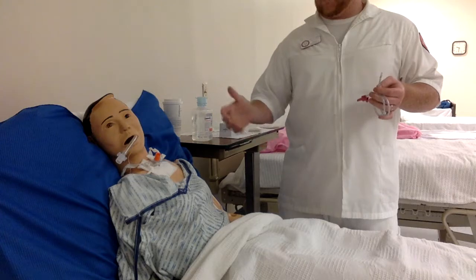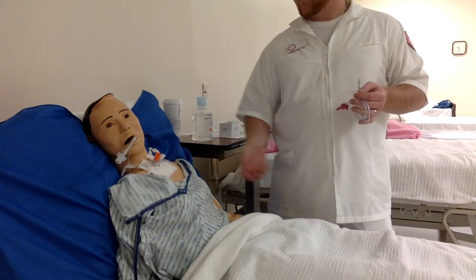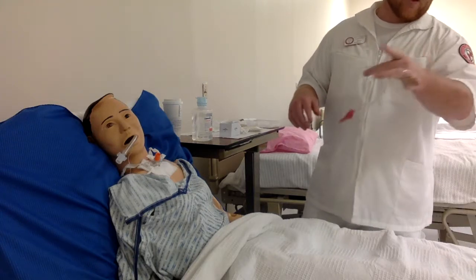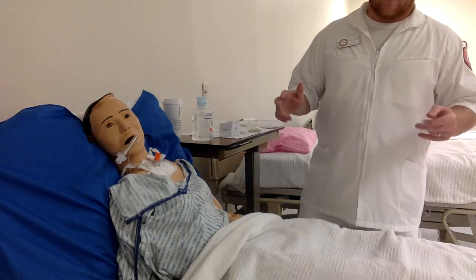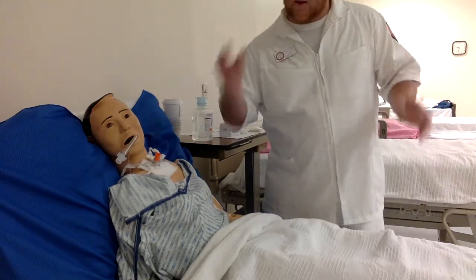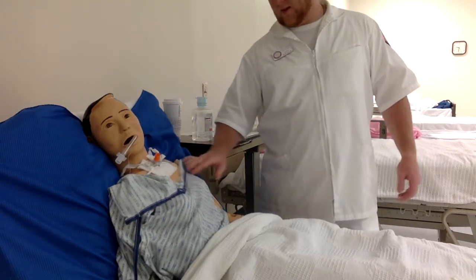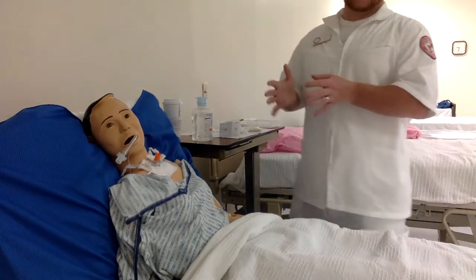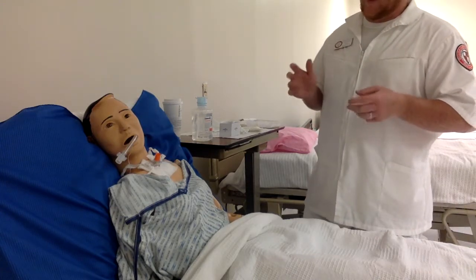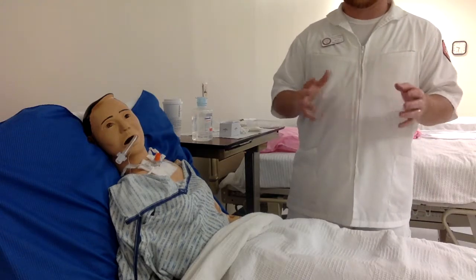After that, your patient should be feeling a lot better — you've suctioned the mucus out of the airway, clearing that passage and improving breathing. Discard everything you used, wash your hands, and turn off the suction. Replace the patient's oxygen, then use your stethoscope to listen to each lung quadrant, making sure there are good lung sounds, no distress, adequate O2 within normal limits, and no new crackles compared to the initial baseline respiratory assessment.